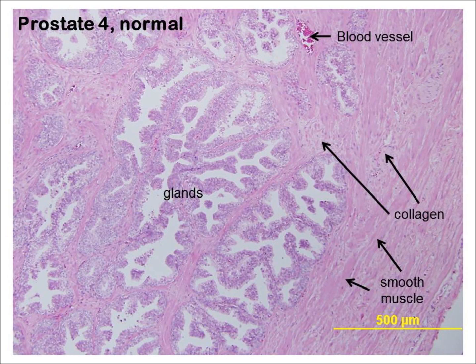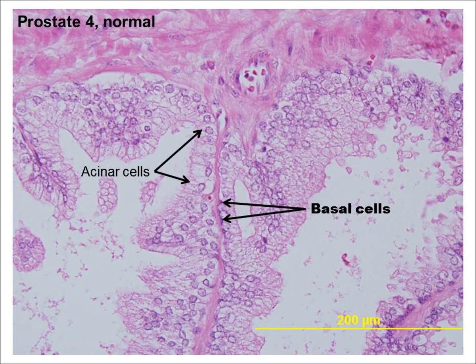Again, at low power, move the slide to the glandular region. Observe the morphology of the glands, which are relatively large and irregularly shaped. The glands are separated from one another by a stroma of collagenous connective tissue interspersed with smooth muscle cells. Switch to higher power and examine the epithelial cells lining the glands. Note that there are two layers of cells: basal cells, which are next to the basement membrane, and acinar cells, which are somewhat columnar. The cytoplasm on the apical end of the acinar cells has a foamy appearance due to the mucin secreted into the lumen. The glands here show a slight hyperplasia, however this is relatively normal.